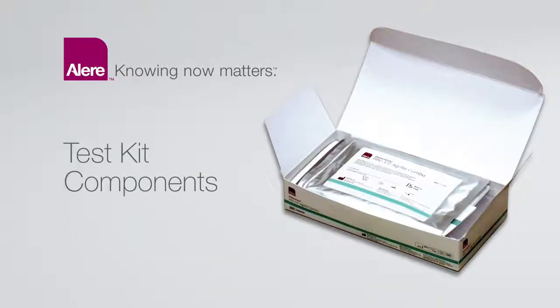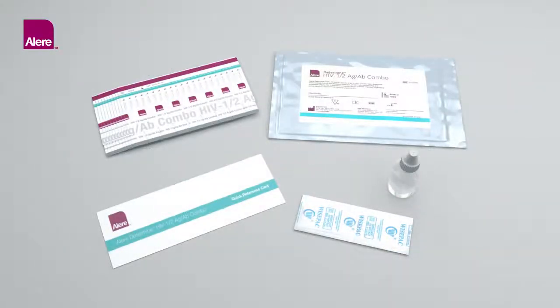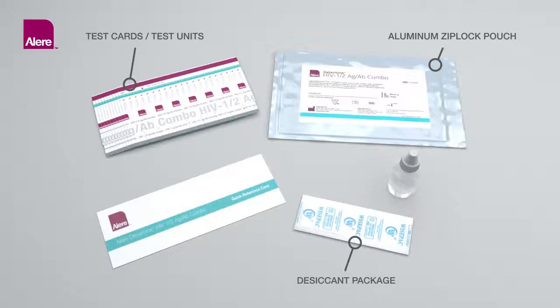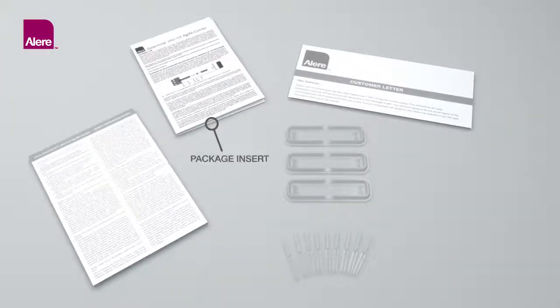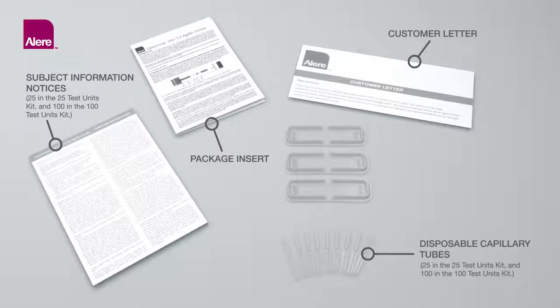Test Kit Components. Each ALIR Determine HIV-1-2 Antigen-Antibody Combo Kit contains: 1 aluminum Ziploc pouch containing either 5 test cards with 25 test units or 10 test cards with 100 test units, a desiccant package, chase buffer, a quick reference guide, package insert, subject information notices, a customer letter, disposable capillary tubes for collection and transfer of finger stick samples, and disposable workstations.